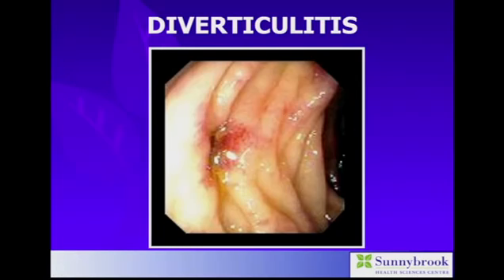We're going to move on now to diverticulitis. In general, diverticulitis causes left lower quadrant pain, which is not the title of this talk. However, there are certain situations in which this disease can cause right-sided pain. The first one is when the sigmoid colon is redundant and extends over into the right pelvis, so that these patients can present with sigmoid diverticulitis causing right-sided pain.